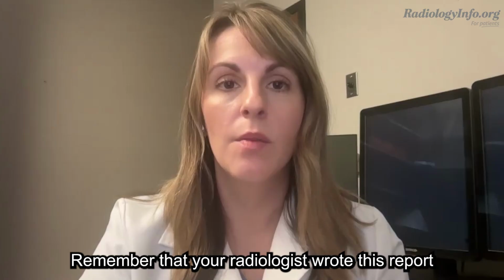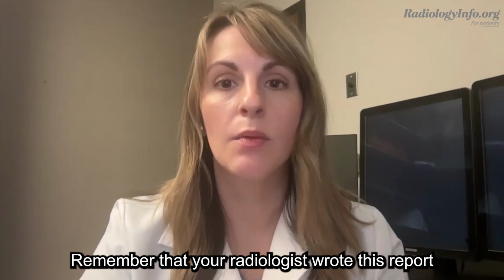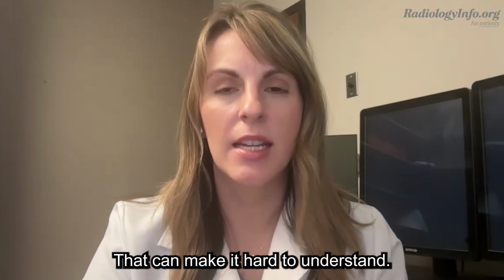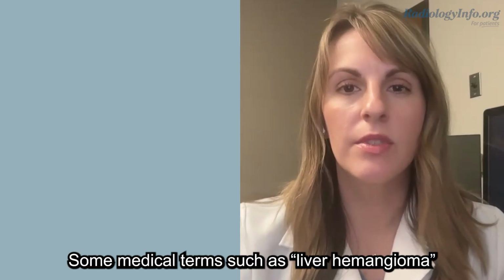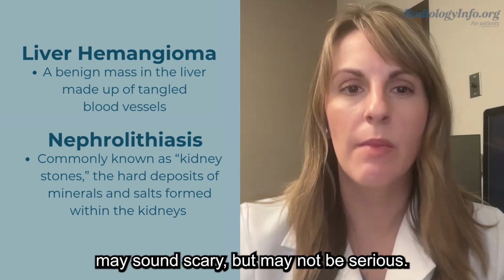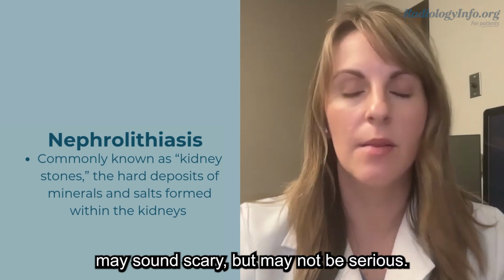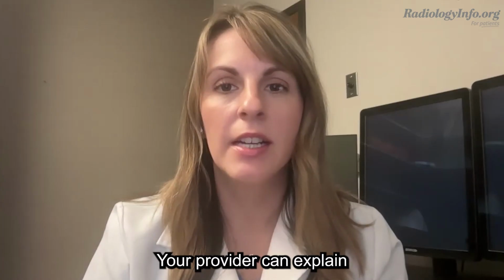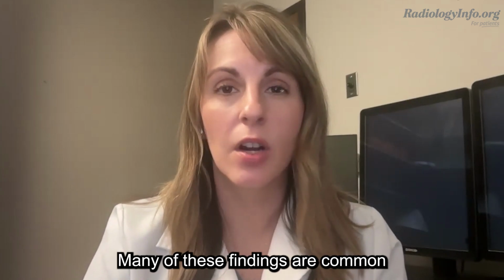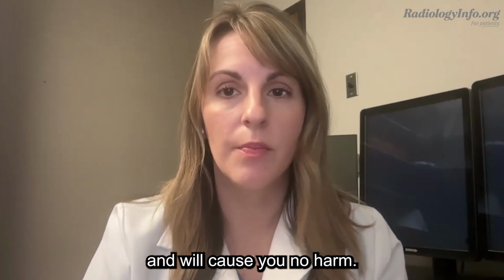bladder. Remember that your radiologist wrote this report for your healthcare provider. That can make it hard to understand. Some medical terms such as liver hemangioma or nephrolithiasis may sound scary, but may not be serious. Your provider can explain any findings mentioned in your report. Many of these findings are common and will cause you no harm.